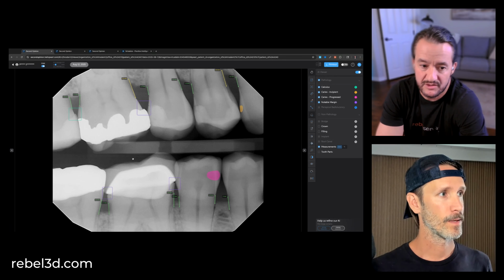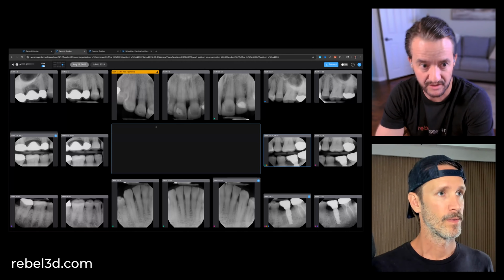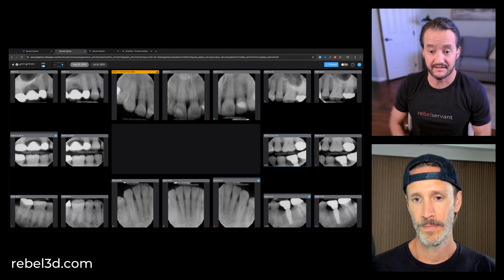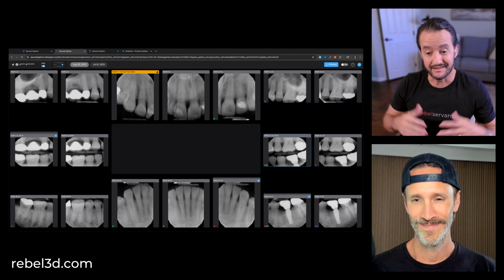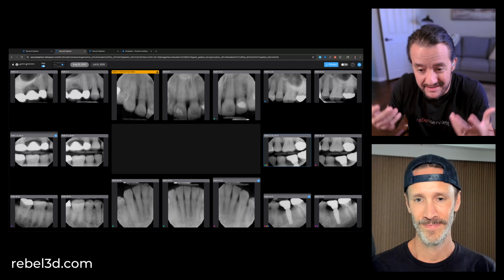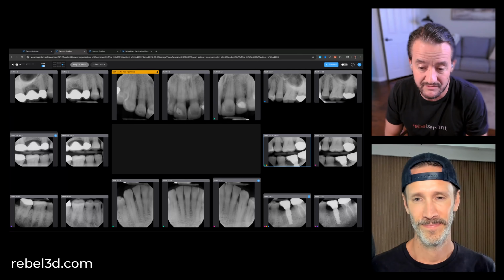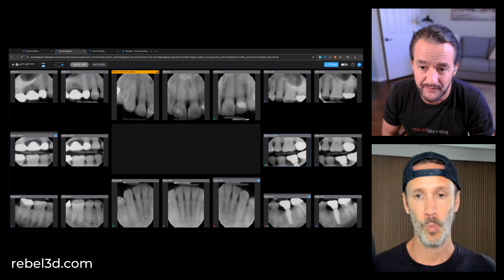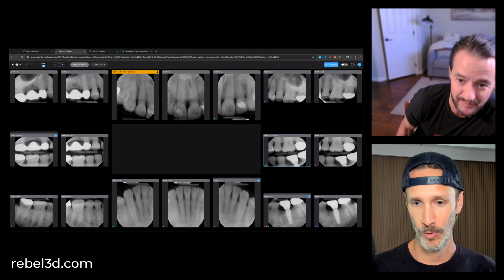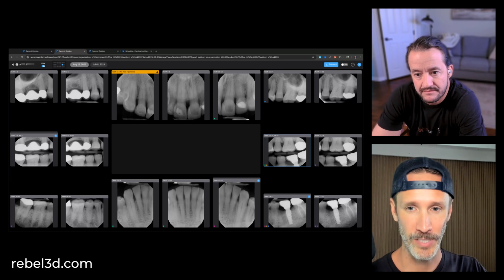So after a doctor's been using Pearl for, let's say, a year, and you have a follow-up call to say, how's it going? What is the common feedback, like, Dr. Kyle, I've been using Pearl now for a while. Man, here's what I love. Here's where it's really helping me. What are the things that they're saying to you as to why I love Pearl after integrating it into my workflow? There's usually 2 things. One thing is my patients love it. My case acceptance has gone through the roof. We've had a lot of practices that have increased their case acceptance by 30%.